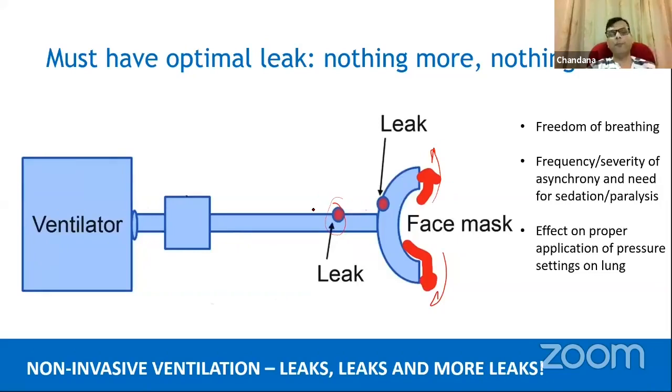So you apply NIV on a conscious, alert, cooperative patient, compared to an unconscious patient. You are not going to apply NIV on an unconscious patient because you have to have the patient's effort and drive to breathe. The patient should be breathing properly, and then you are just going to support the patient's breath. When the patient tries to breathe, you increase the pressure. When the patient exhales, you drop the pressure. That is how BiPAP or NIV works.